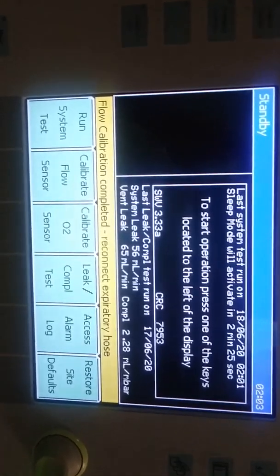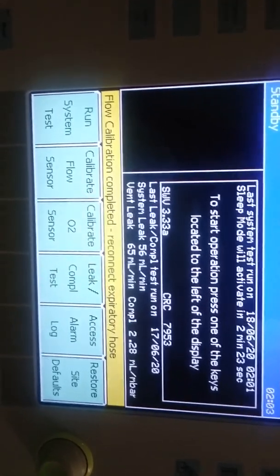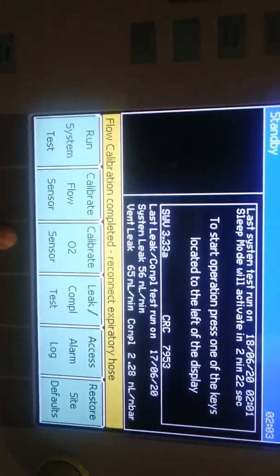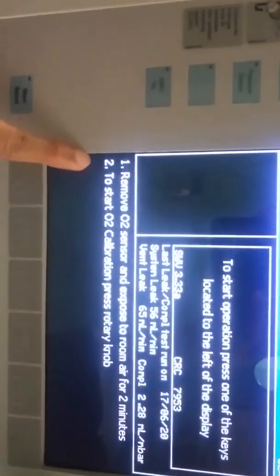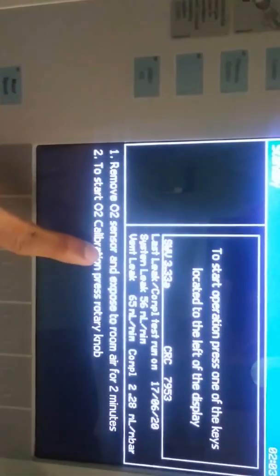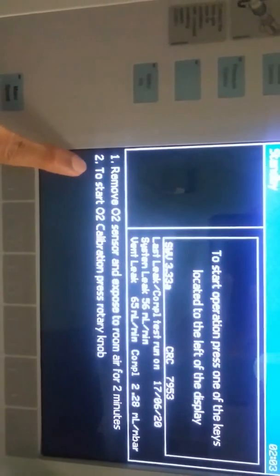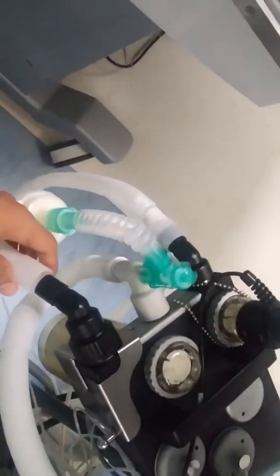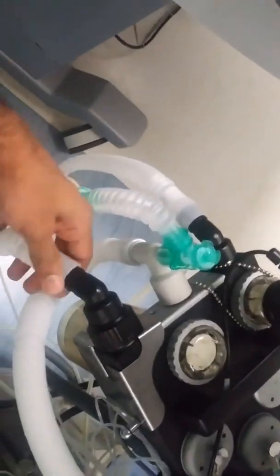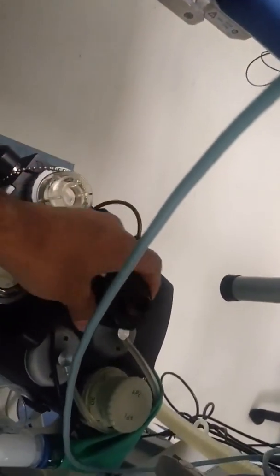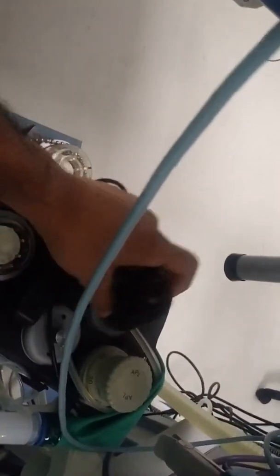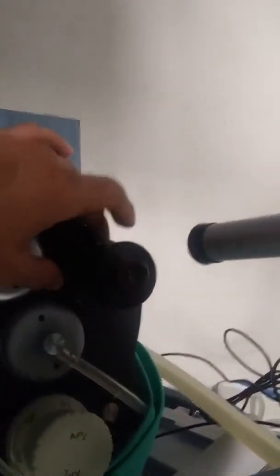Next is oxygen sensor calibration. First select the option then get the mandatory steps. First remove oxygen sensor from breathing system for two minutes. The oxygen sensor is situated near inspiratory limb. Second step is press the rotary knob to do calibration. After some time we can get the result - sensor calibration passed or failed. After complete calibration reconnect the oxygen sensor to breathing system.